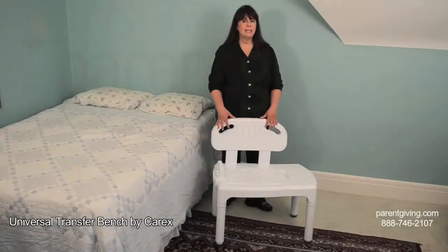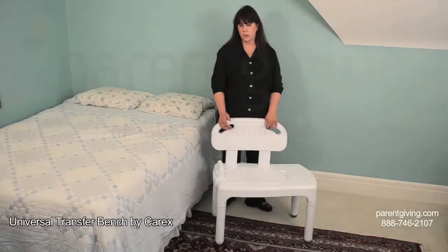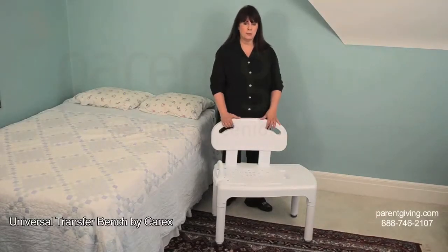When it comes to bathroom safety, getting in and out of the tub is an area that you want to address. The Carex Universal Transfer Bench is the answer to two different needs: getting in and out of the tub — that's the transfer part — and safety inside the tub — that's the bench part.